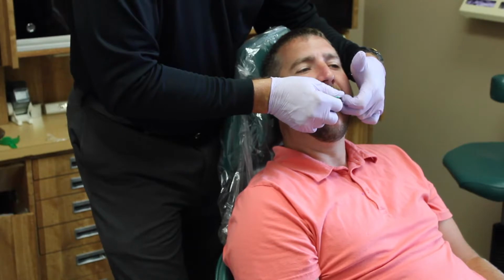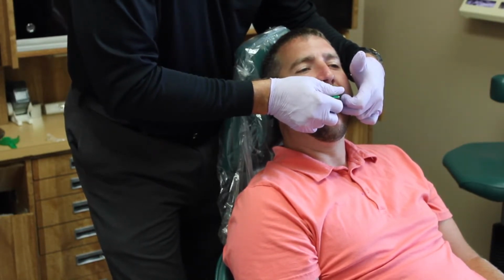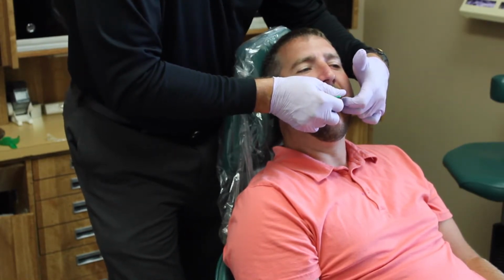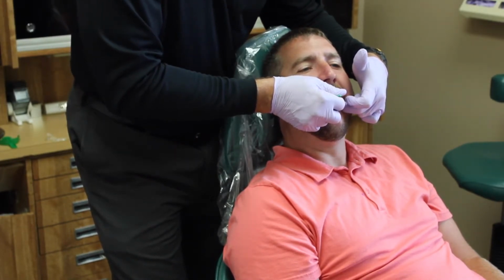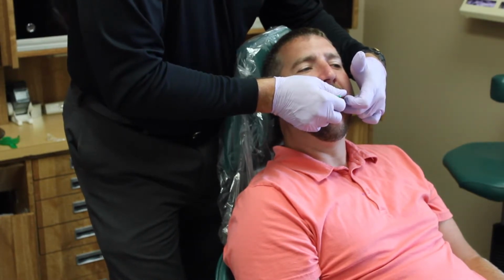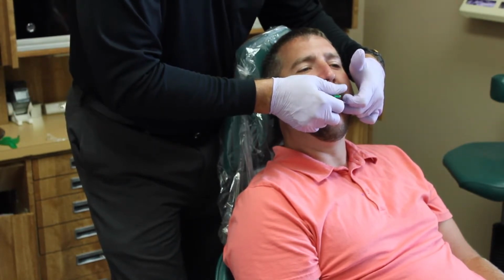Works great. And if we have some inconsistencies or inaccuracies in a little buccal corridor or in between a couple of teeth, or we've got a bubble on the proximal or a buccal or a spot on the tooth, it doesn't really matter as long as it doesn't impact the preparation area and the opposing dentition. Here, every tooth is like a preparation. Every opposing tooth is presented with one of the restorative teeth opposite it. So every single tooth in the upper and the lower arch needs to be captured exquisitely.